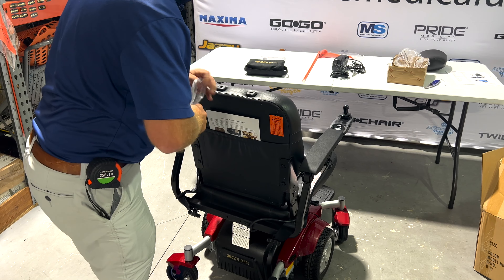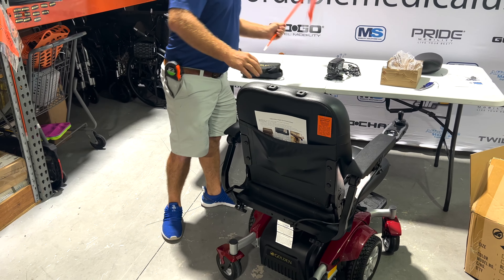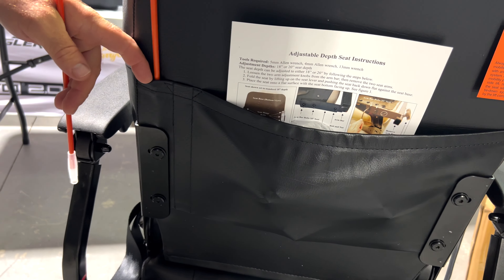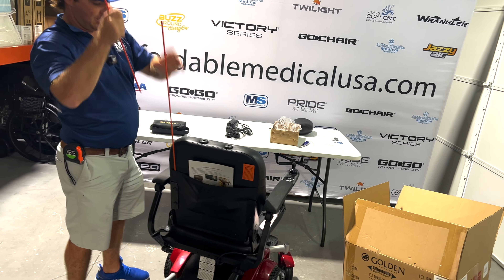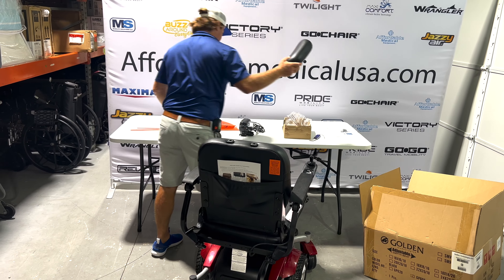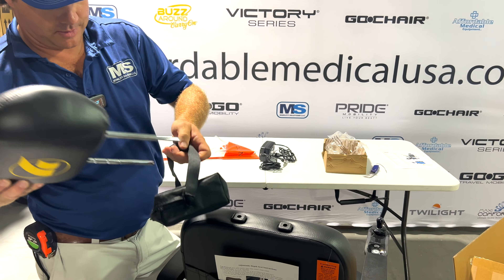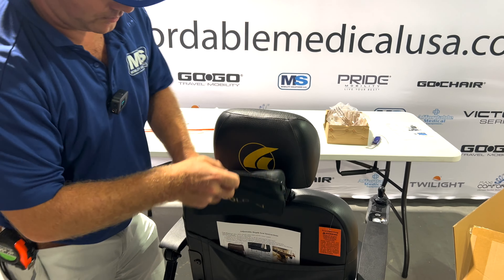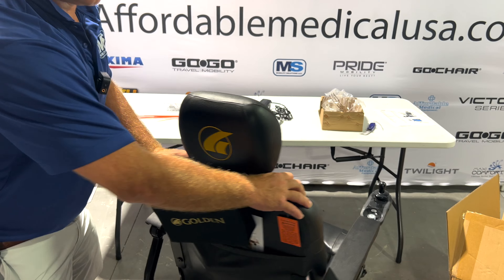This is a demo unit, so it's not going out — we're just going to set it up how we want it. Golden sends out flags — you don't have to pay for them. There's a little pocket right here that these can be put into. Now, you can remove these off and make it a little bit lower if you need to. And then you have the headrest — the headrest can go like this. Before you put that headrest on, you can also Velcro this off. You can take that little charger case that comes with it from Golden, put your charger in here — there are some instructions about the charger and different things you need to know.